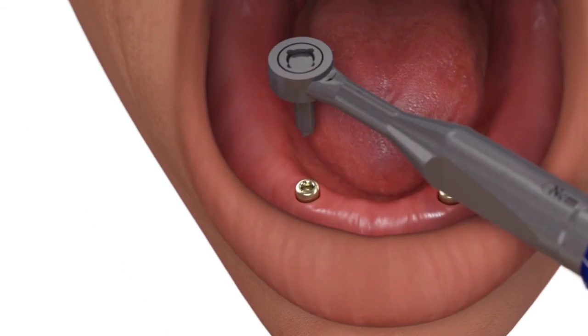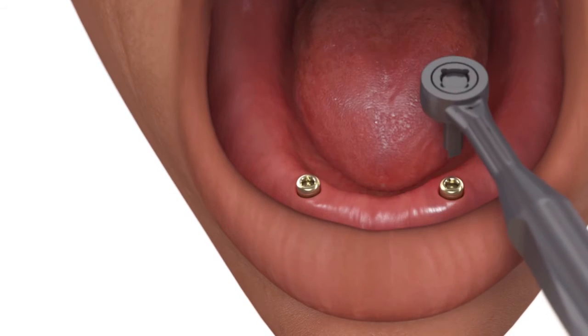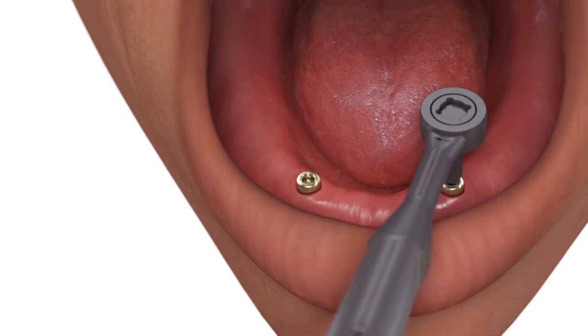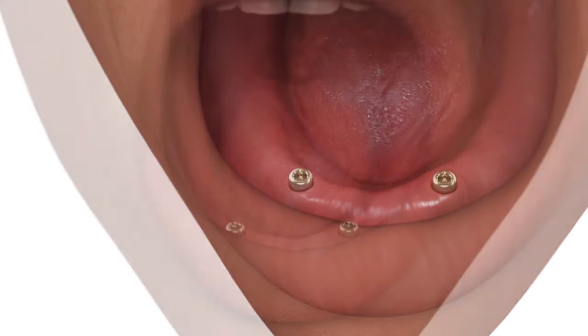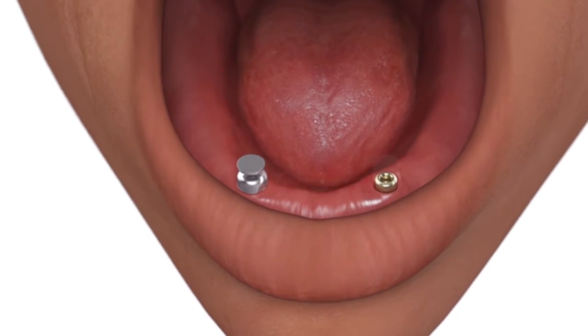Tighten each locator abutment to 30 newton centimeters using a calibrated torque wrench and a locator square drive tool. Snap the impression coping onto each locator abutment.